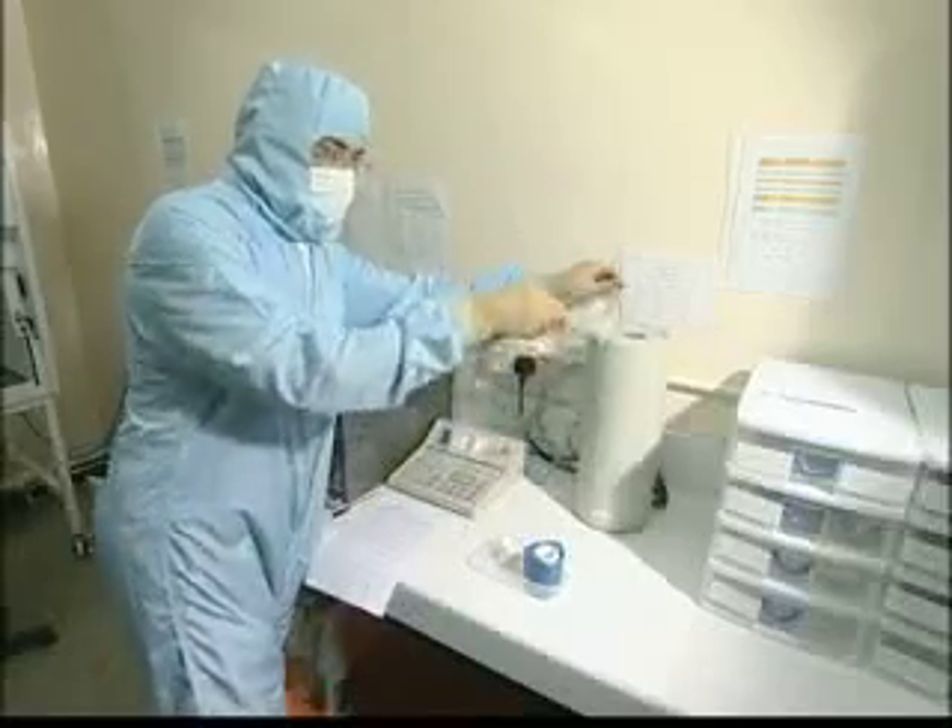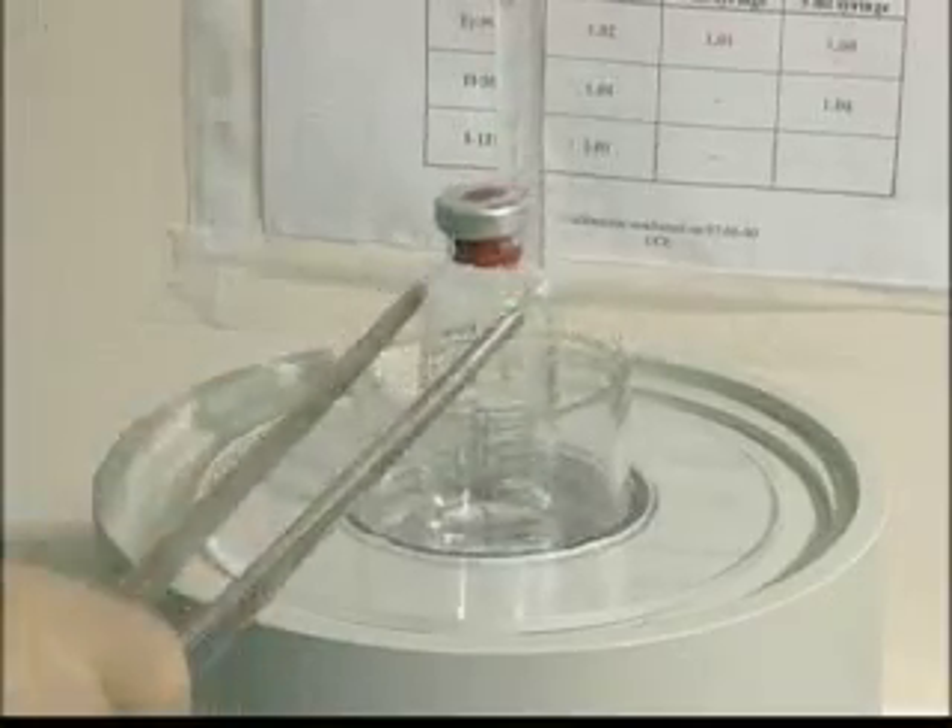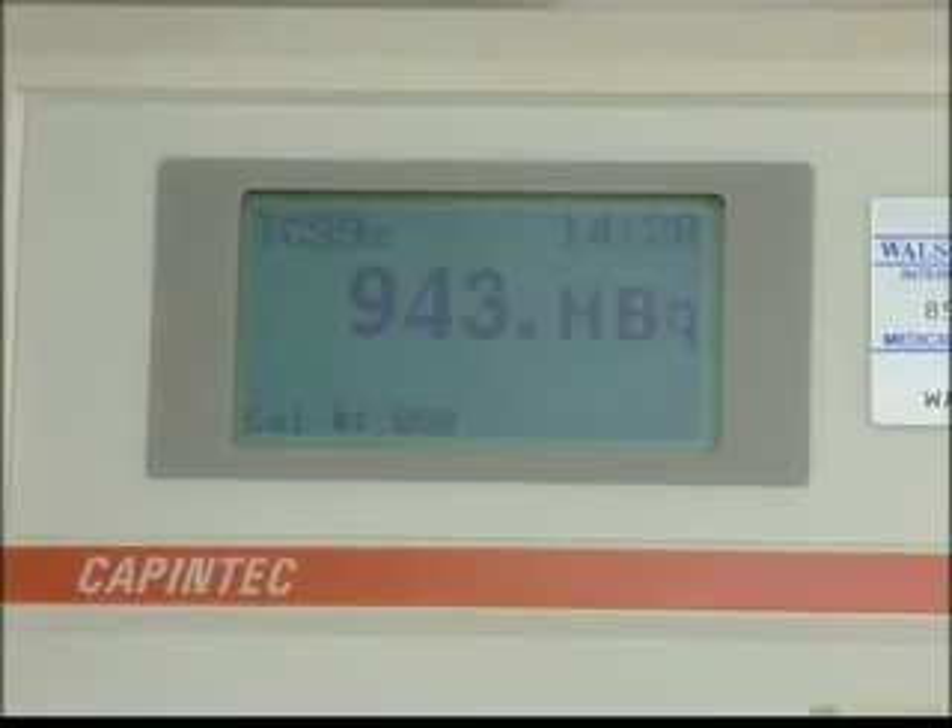Having drawn off the sodium pertechnetate, it is important to measure and record the activity of the eluate.